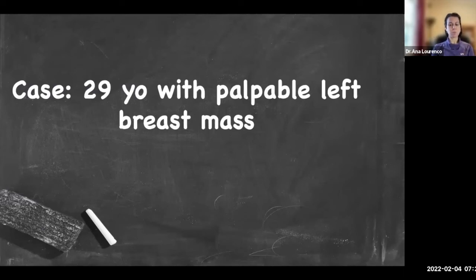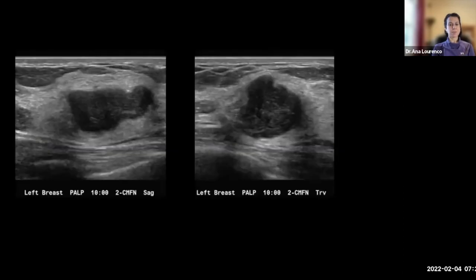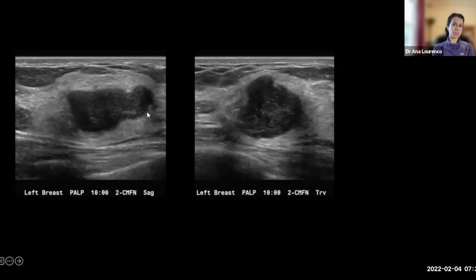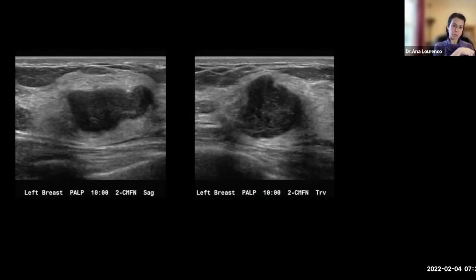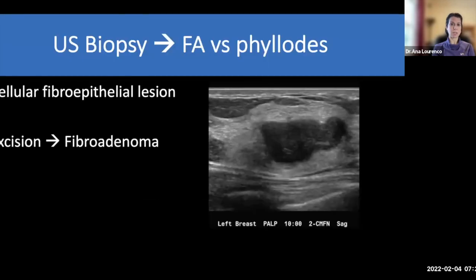Next, a 29-year-old with a palpable left breast mass. We have a hypoechoic mass that looks solid, not much change in posterior features, and the margins look pretty lobulated. This is the type of appearance I would biopsy rather than follow — even though statistically it's still likely a fibroadenoma, the appearance is not classically benign enough. I always ask myself: if this is a cancer, do I want to miss a cancer this big? No. The pathologist reported a cellular fibroepithelial lesion with differential of fibroadenoma or phyllodes, so it went to excision and turned out to be a benign fibroadenoma.